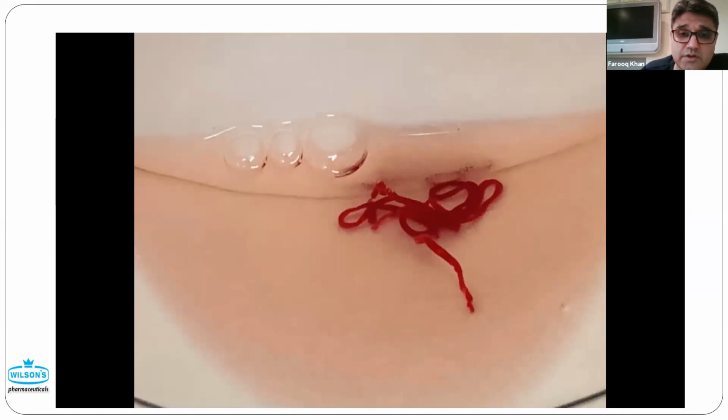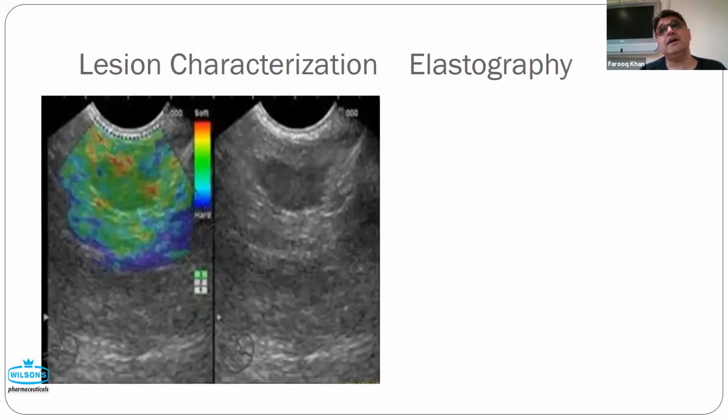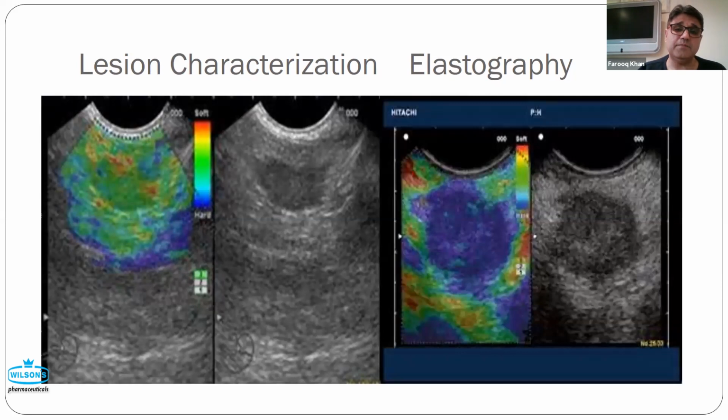He's now on chemo. Can I characterize these lesions better? Yes, there's elastography. Dr. Nadeem Tahami's center uses a lot of this, and he presented a couple of weeks ago. That was a decent talk. And I would encourage you guys also to consider it. Very simple.